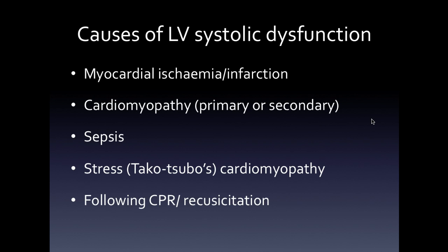Sepsis is a very common cause of significant and transient, hopefully, left ventricular dysfunction in the acutely ill patient and is often missed because the patient comes in under, for example, the surgeons with a hot gallbladder, gets septic as be damned, is managed in a surgical manner, then somebody says, well, they're not doing well, and the ECG doesn't look too different, but you put the echo probe on them, and lo and behold, the LV function is down because they've got sepsis running through, and that's where the intensivists get involved and save the day, I hope.